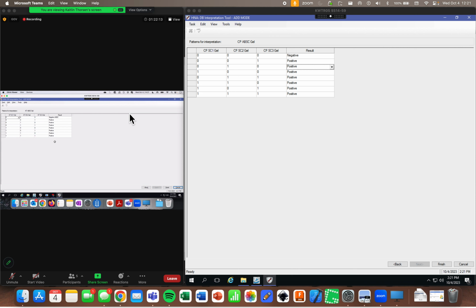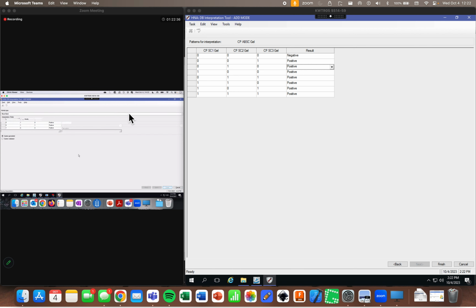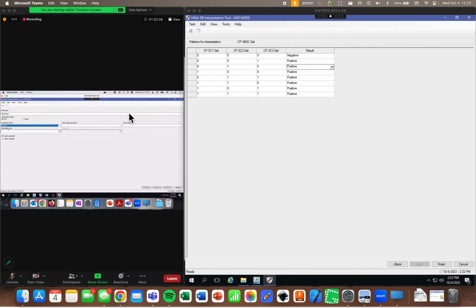Right, any other questions? Oh, you know what? Oh, go right ahead. On the ABO interpretation, the result, we get those blood types like the O positive, because it's on the reference table, right? That it's already built. Correct. Yep. That's the reason we don't have to define the alpha responses, because it's already out there in the reference table. You got it.